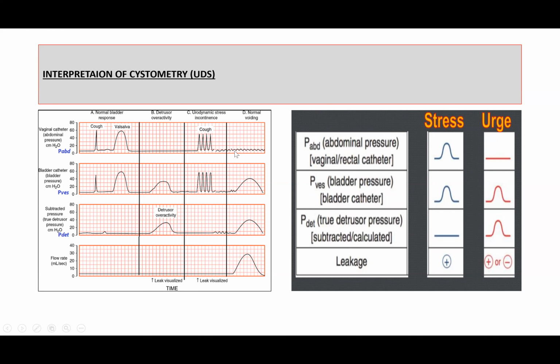During the filling, what about the abdominal pressure? No rise. Sorry, this is the voiding phase we are discussing about. So voiding, we will see the curve, bell-shaped curve. All right. So this is the normal voiding pattern. There is a bell-shaped curve.